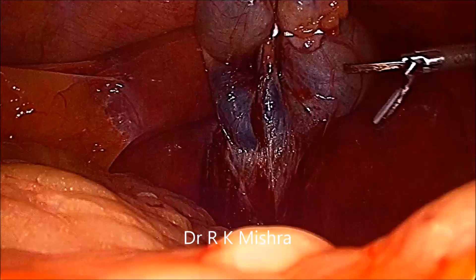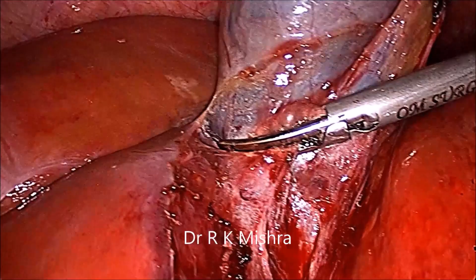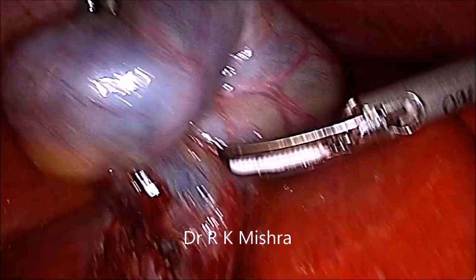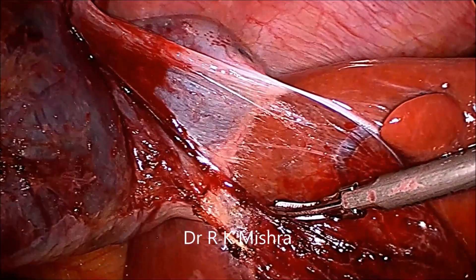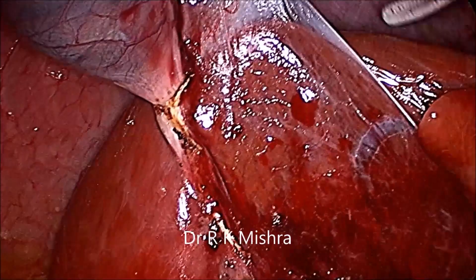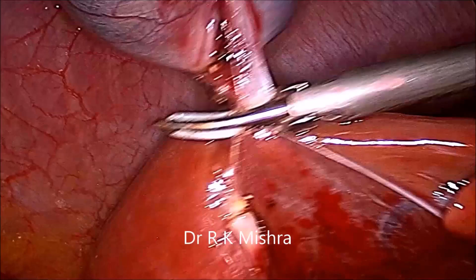The light cable of the telescope is brought down so that you can see up. It's a good avascular plane. Then you can separate the gallbladder from the bed. During that separation, care should be taken that you should not puncture the gallbladder — keep the harmonic at the proper avascular plane, separate it from the liver.